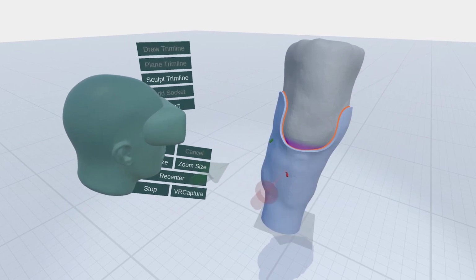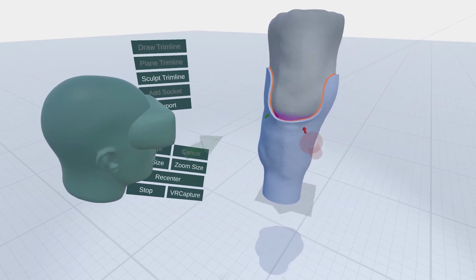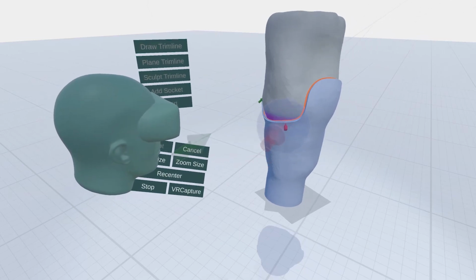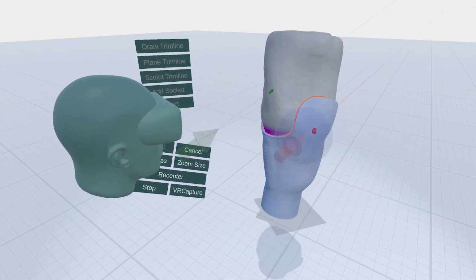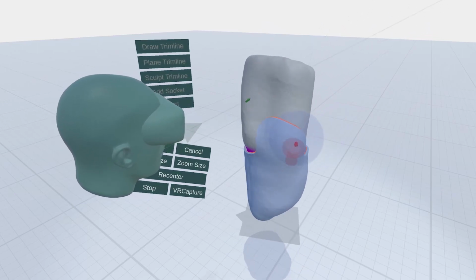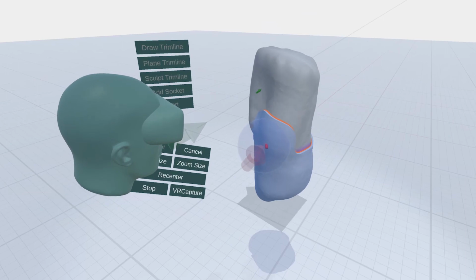Finally, once the trim line is set, the prosthetist can generate a socket. The 3D printable socket is a thickened shell that conforms to the reshaped limb, with a standard connector smoothly blended into the base. If tweaks to the trim line are necessary, the socket automatically updates.